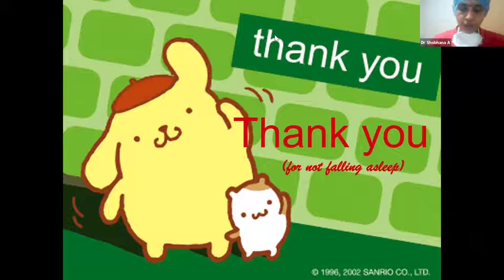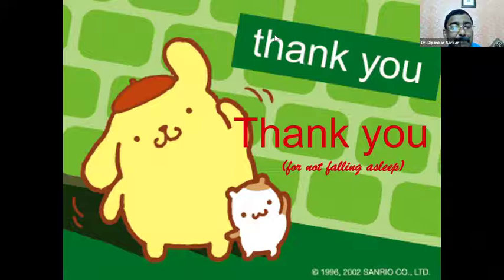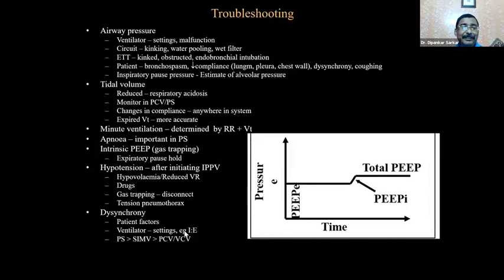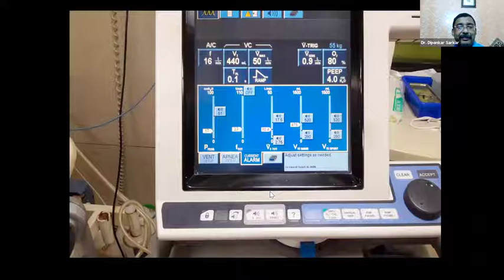What is the difference between tidal volume and minute volume? This is a very basic question. Does anybody want to answer from the participants? So let's go back to the ventilator setting picture, so they will understand the difference. If you see the alarm setting, you see the tidal volume with each breath. How much volume you are taking with each breath is the tidal volume.